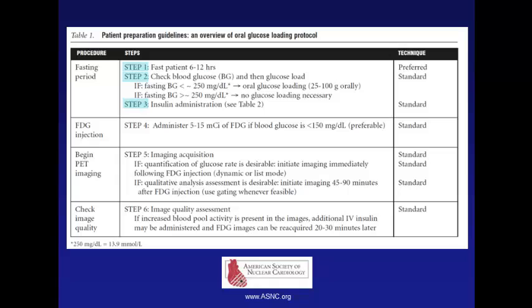Type 2 diabetes patients can be very tricky. And there, certainly MR has big advantages, is not prone to any of these problems, may have other problems, but certainly this is not an issue with MR. You give then the FDG, and then you make an image acquisition.